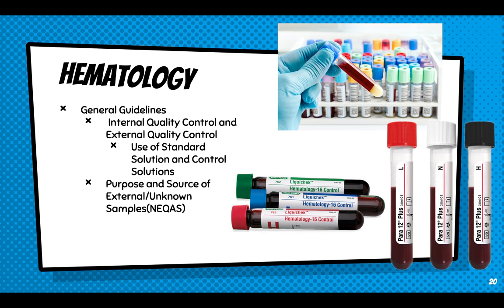Sir, why do we need to have three levels of control? Why is there a need to have multiple level controls? Since you want to assess the stability of your machine and the quality of your reagent, you also have to make sure they are able to measure the lowest concentration, the highest abnormal, whether it is normal or abnormal, and also the normal controls. That's one very good reason why we have multiple level controls.